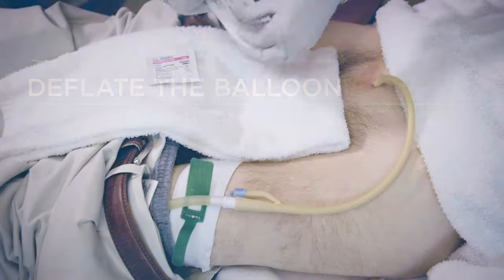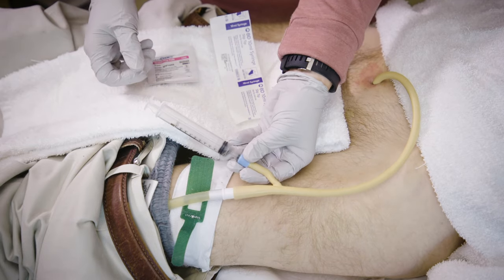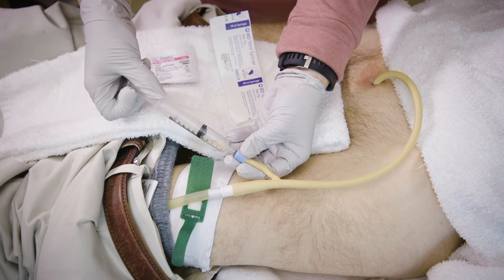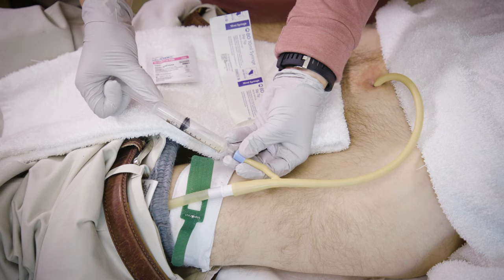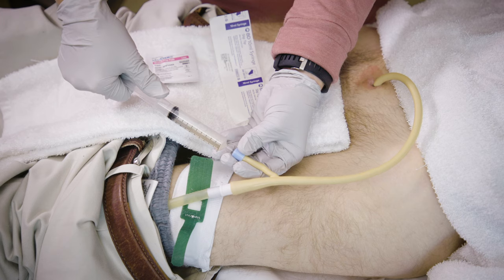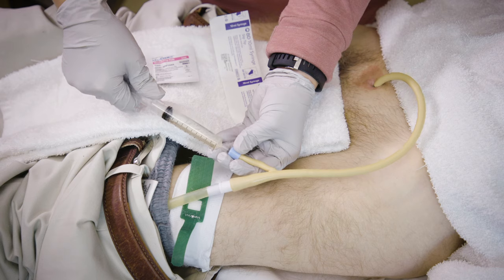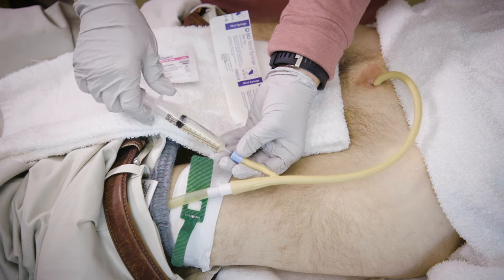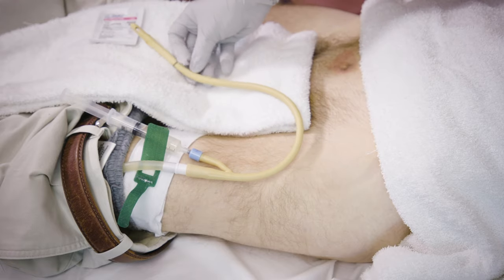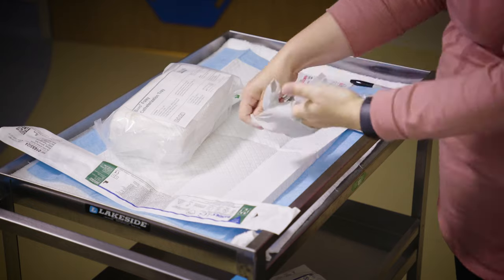Attach the empty syringe to the colored port of the old catheter. Pull the plunger back on the empty syringe to deflate the balloon. The syringe will start to fill with liquid. When the plunger stops moving, manually pull the plunger back two to three more times to ensure the balloon is completely deflated. Now pull the old catheter completely out of the person and lay it down on the clean towel. Remove your non-sterile gloves.